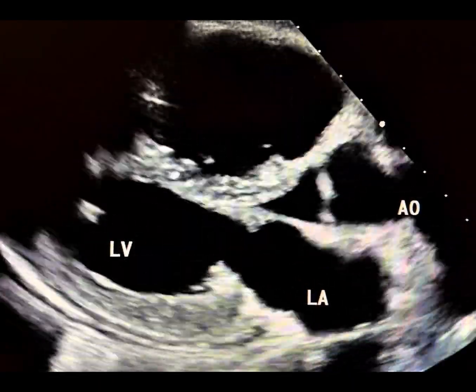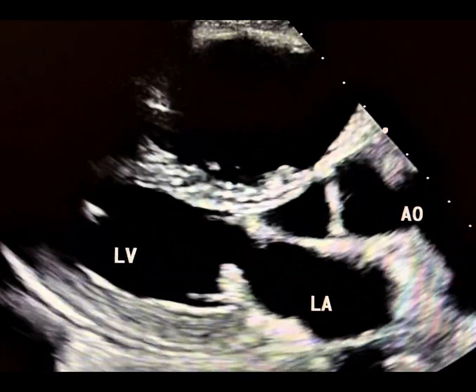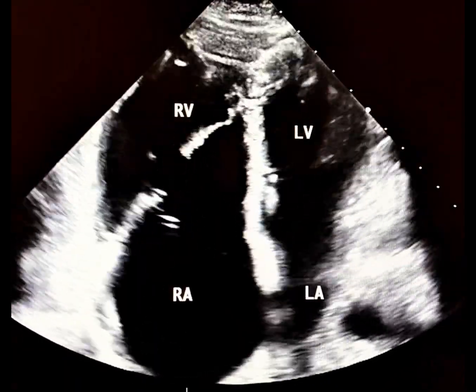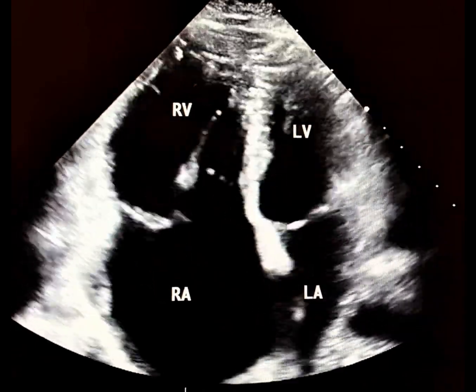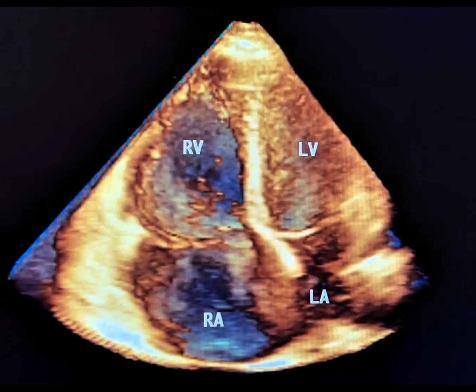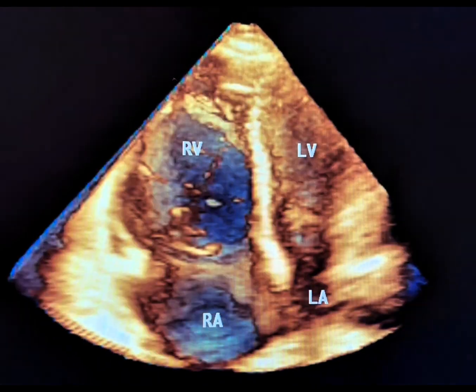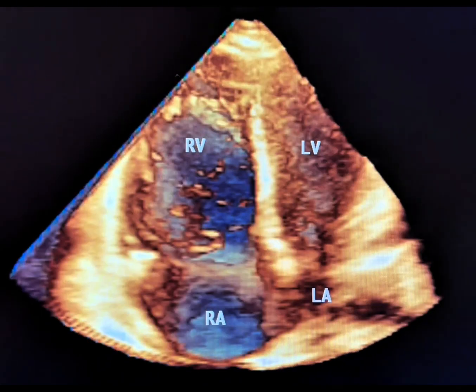This ECHO study belongs to a patient with dyspnea on exertion. This four-chamber view demonstrates severe right ventricular (RV) enlargement. RV enlargement typically raises suspicion for shunts, such as atrial septal defect.